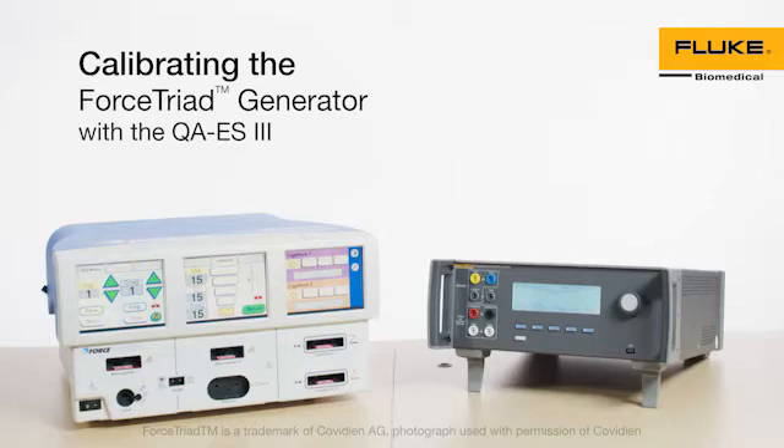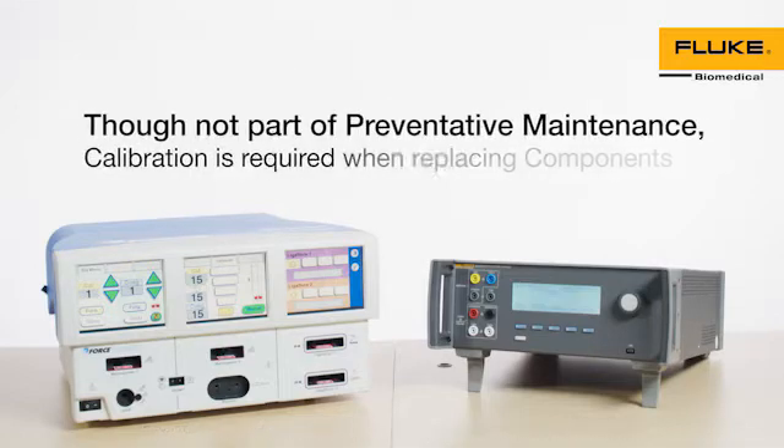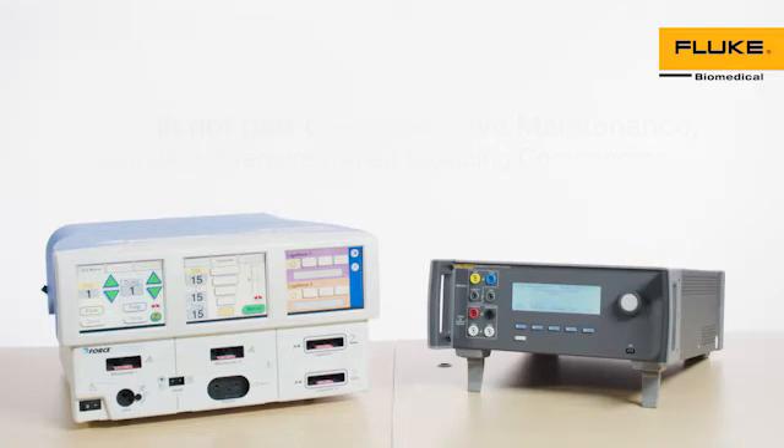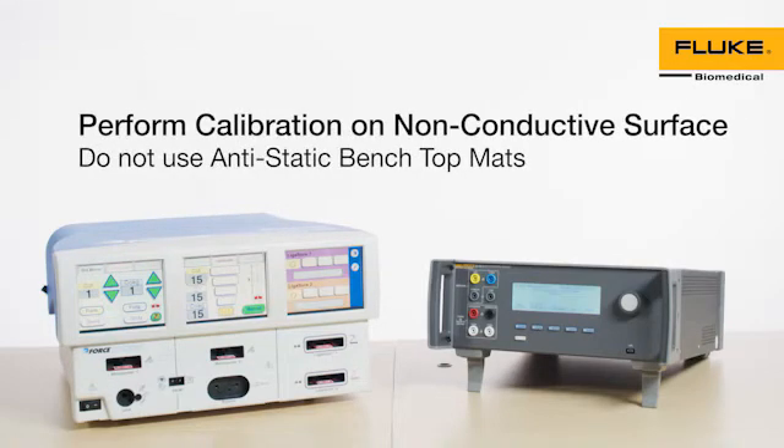You should calibrate the Forced Triad before performing routine maintenance. While calibration is not part of preventive maintenance, it is required when components are replaced. Make sure the calibration is performed on a non-conductive surface. Do not use anti-static benchtop mats.